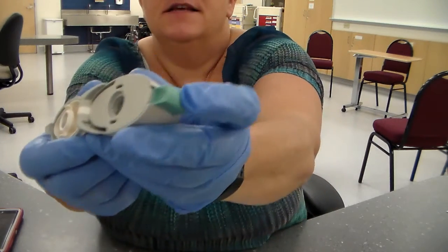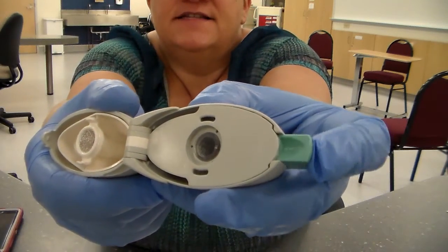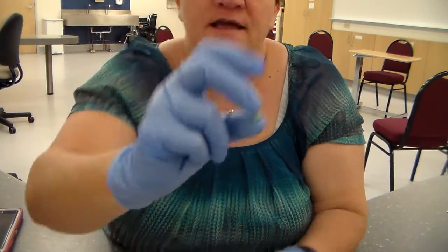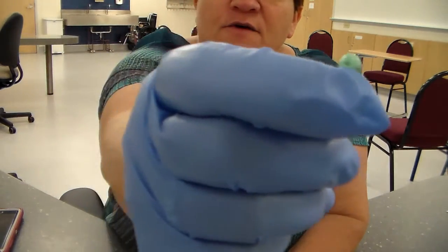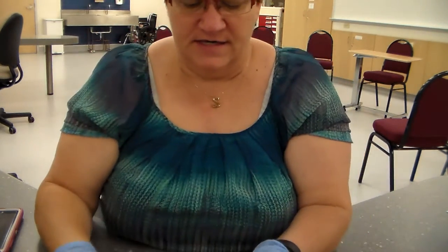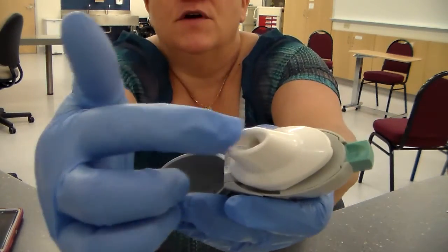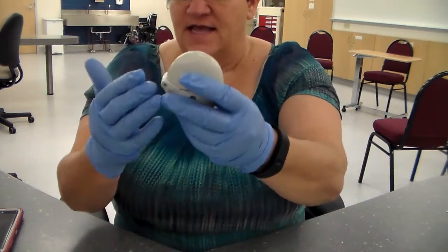Now when we push this green thing right here, there's a needle inside that will pierce the capsule. The capsule looks like this. I don't know if you can see the piercing. I'm trying to hold it right. Okay, there we go. There's a piercing on there. And when it pierces it, it allows the patient to breathe up through this screen. The medication will come up through here and they'll be able to breathe it in. All right, so that's the inhaler.